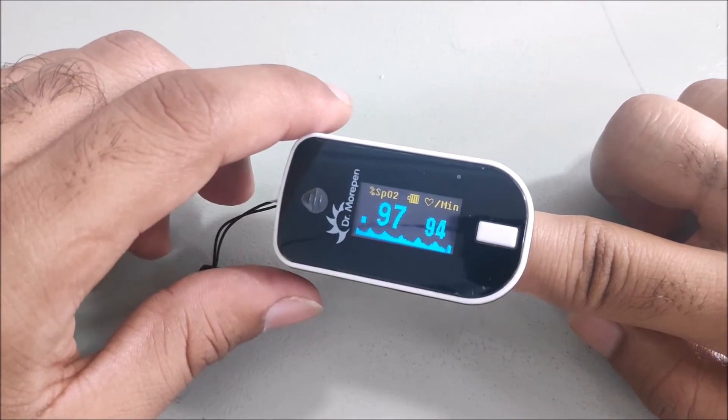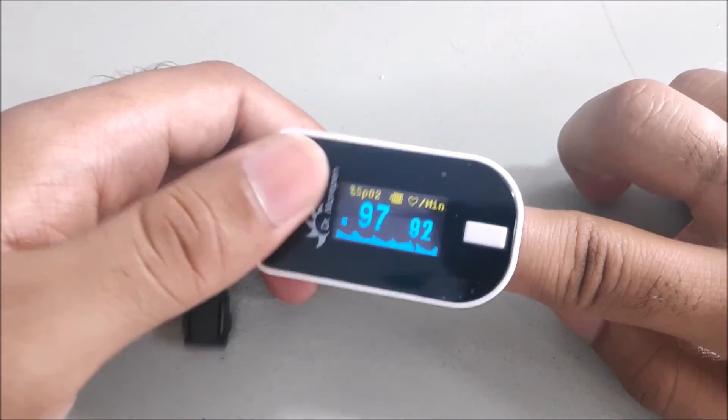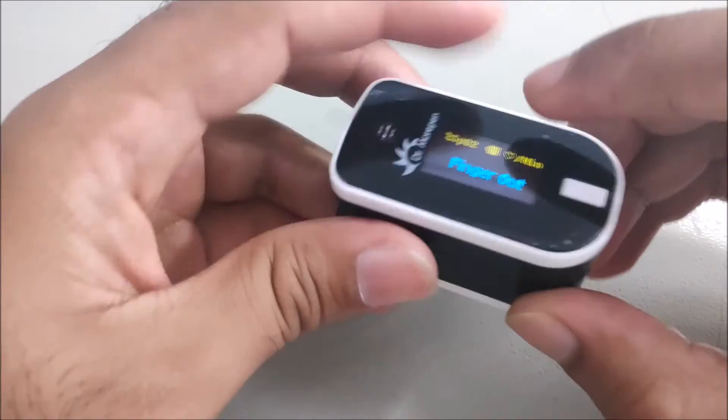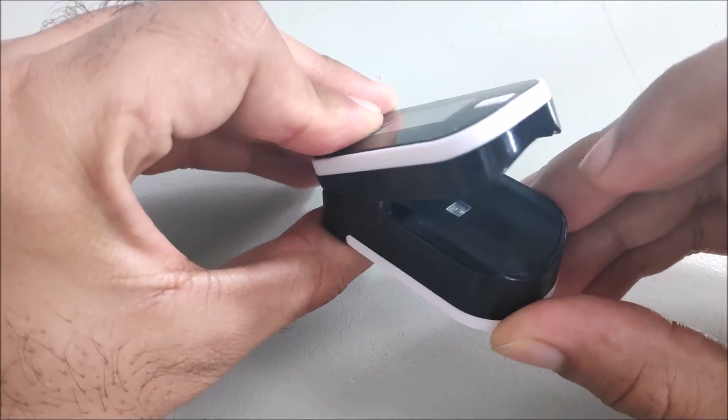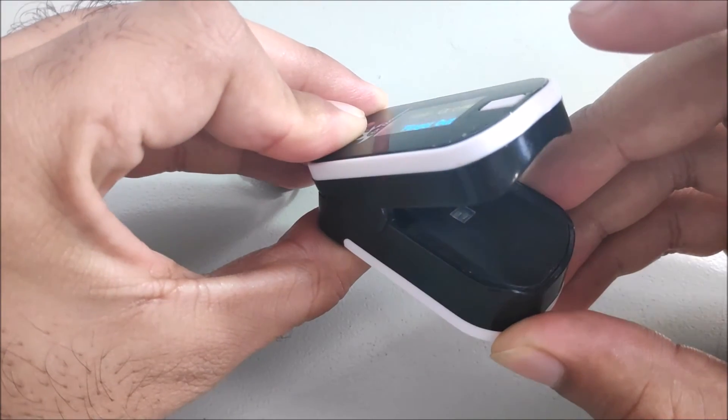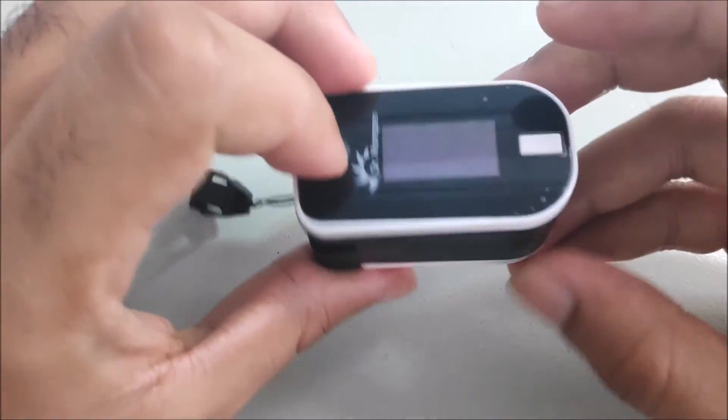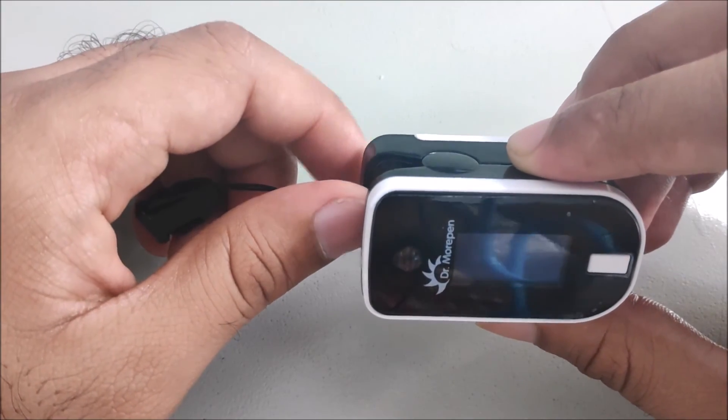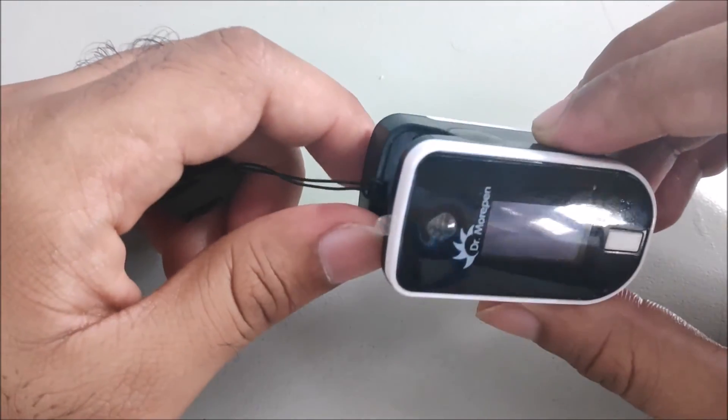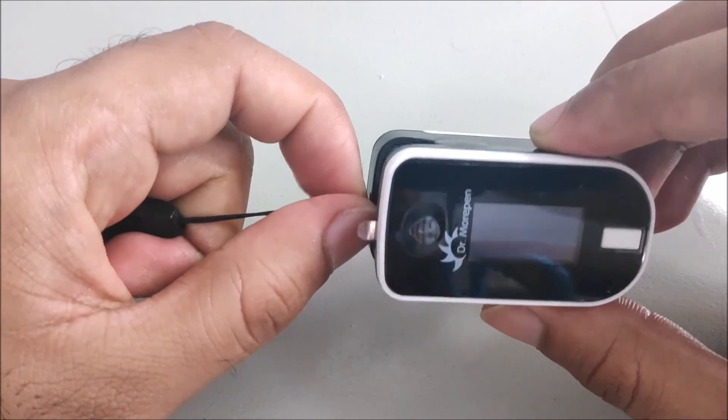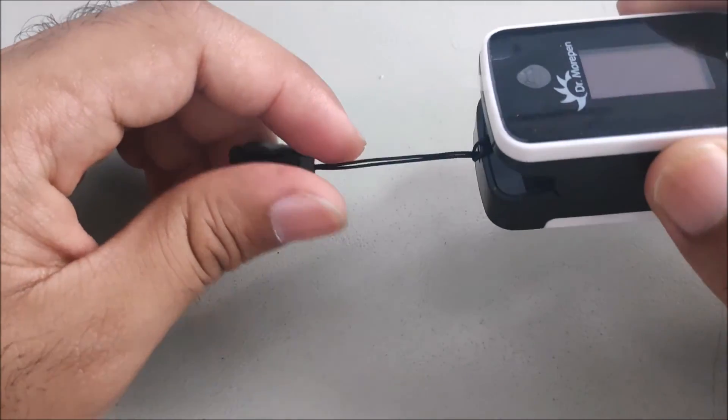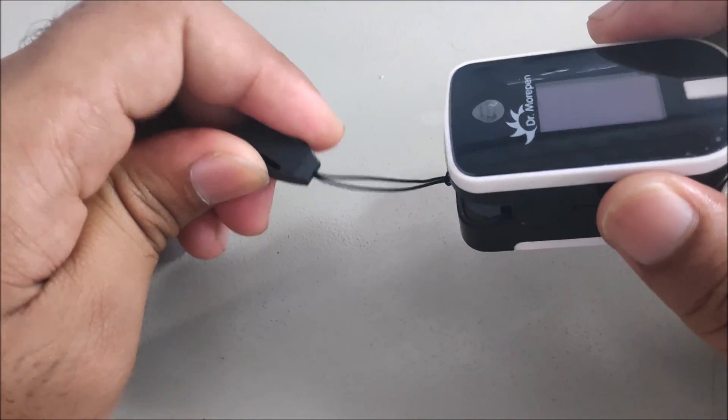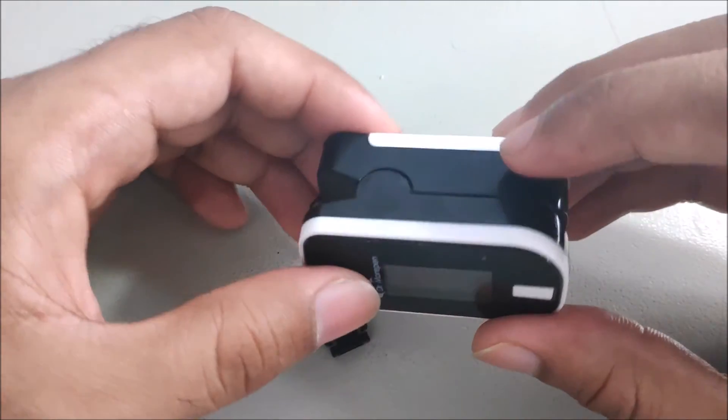This pulse oximeter has a light you can see. This is the light blinking at the base which gives two wavelengths. After their reflection and measurement of the oxygenated blood, the oxygen saturation in the blood is calculated.